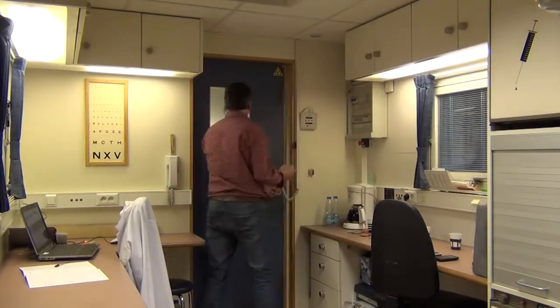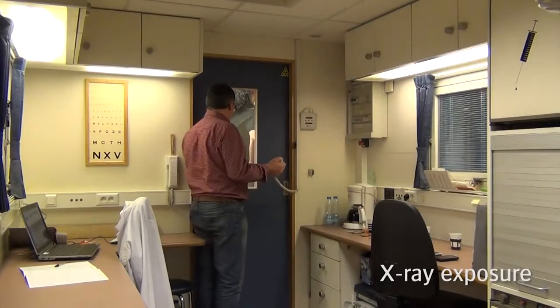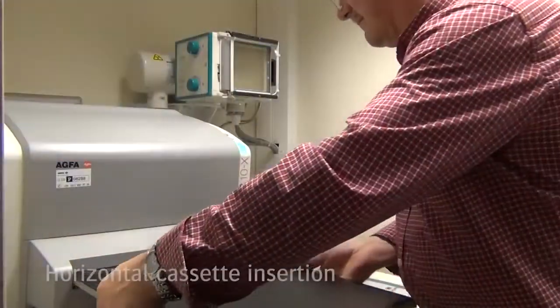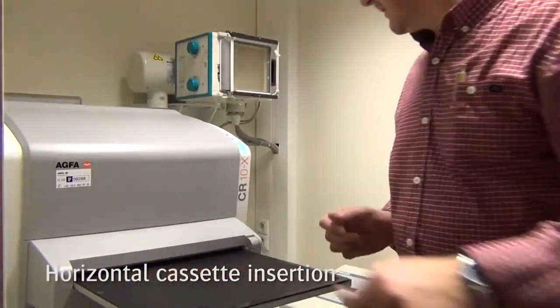We are ready now to make the X-ray exposure. The patient study needs to be opened from the Worklist and the cassette should be inserted to read out the X-ray image.